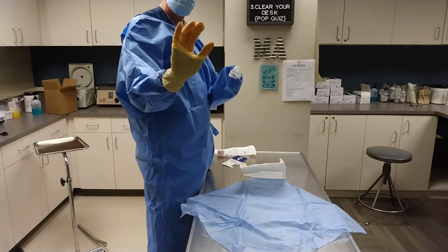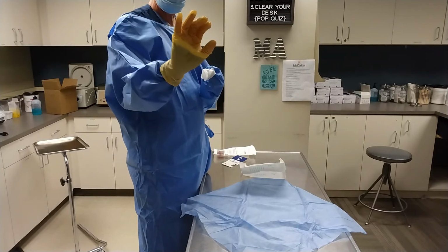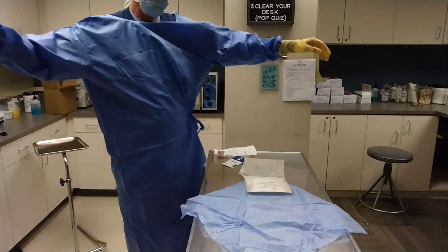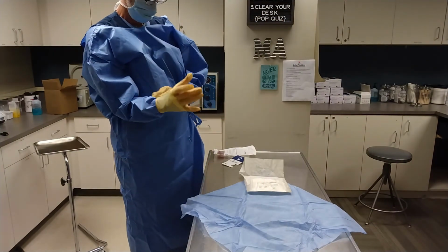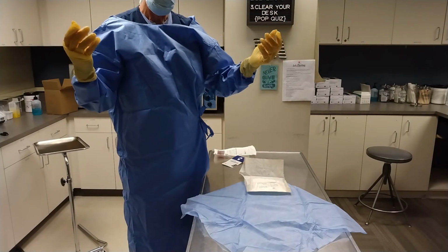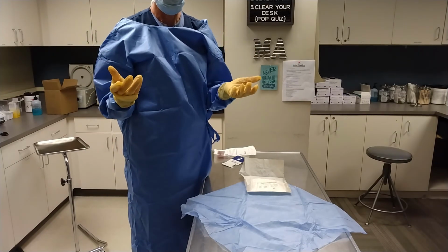So see how the glove is still way up on my palm? That's good. Creates a nice overlapping barrier. Cuff of the gown well up my hand. And I have long arms, but see, I can still at least have extra long sleeves. And I'm scrubbed in. I'm gowned and gloved up. We don't have surgical caps here, but you definitely, the first thing is to make sure that your hair is covered.